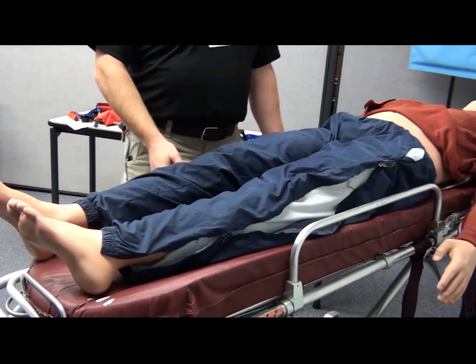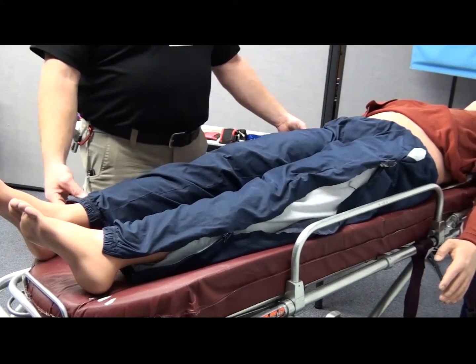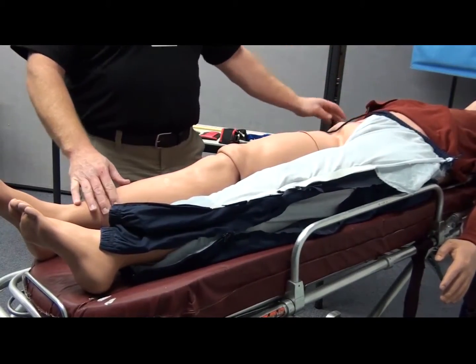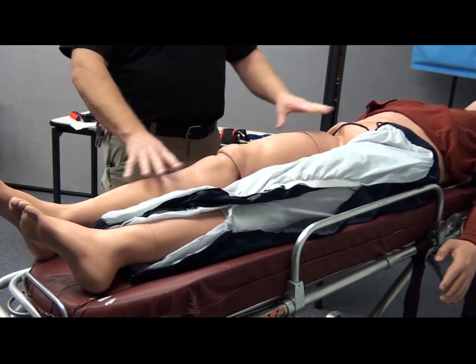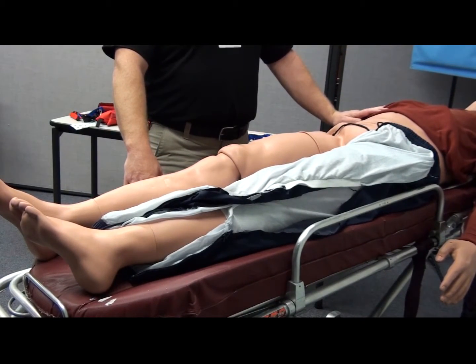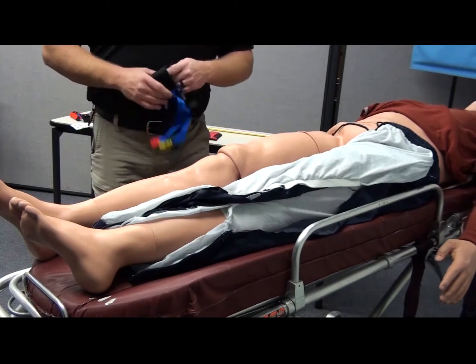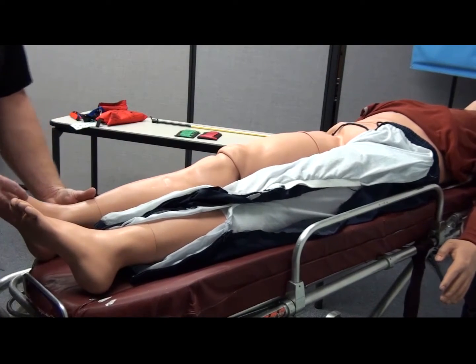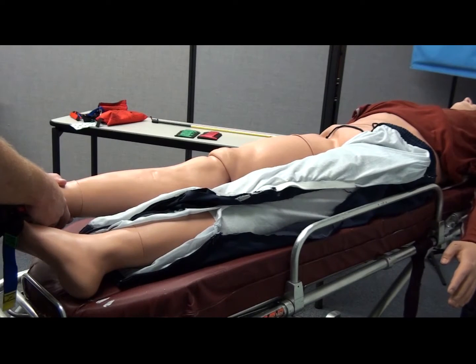Alright, so for our patient, the one thing that we will need to do is expose the injured leg itself. Obviously, cut up the side of the pants, and we roll that out of our way. So now that we have our leg exposed, and there's not a lot of bulk around the patient where we have to do a lot of the work. So next, we'll use the ankle hitch. Obviously, it's a closed mid-shaft femur fracture. Someone should be holding and pulling traction the whole time. As someone's pulling and holding traction, your job or someone else's job should be to put the ankle hitch.